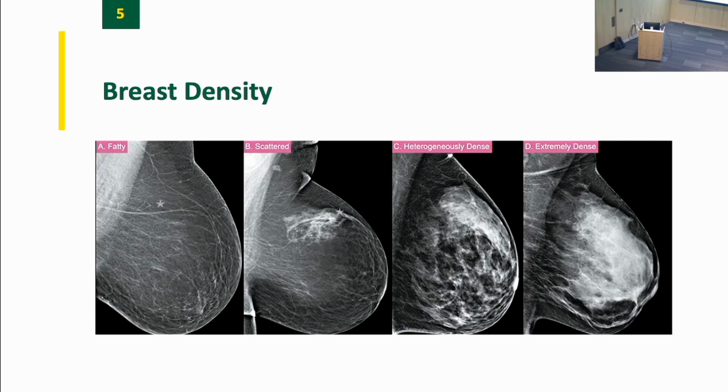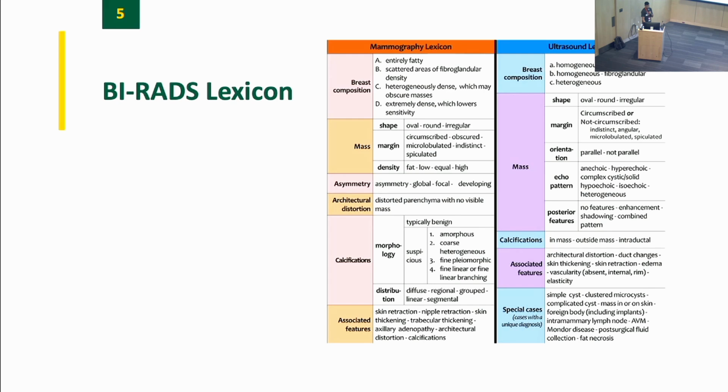So cancer tissue is tissue. It gets masked by the fibroglandular tissue in the breast. Here, I have these stars. They're all exactly the same. I copy pasted the little shape. Look how hard it is to see that star of the exact same color and intensity on the dense breast. This is exactly the problem in breast imaging: cancer gets obscured by the surrounding tissue. Questions?